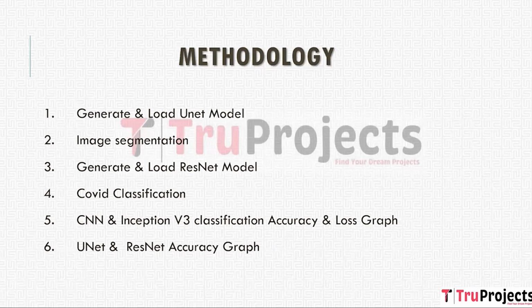Coming to methodology, we have designed these modules. First one is Generate and Load UNet model. This module involves creating and loading a UNet model. UNet is a deep learning architecture used for image segmentation. This module sets up the foundation for performing image segmentation on medical images to identify COVID-19 affected regions.